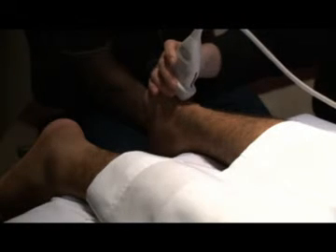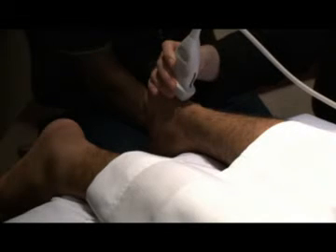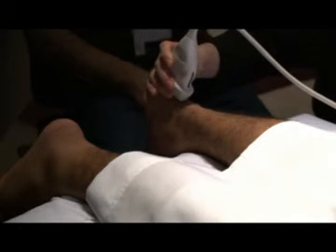You see how useful ultrasound is. We detect things which you would not detect by X-ray, but you have to put everything together. Spots here, and they are not attached to the bone, so it's obviously calcifications. However, we cannot say what it is, yeah?